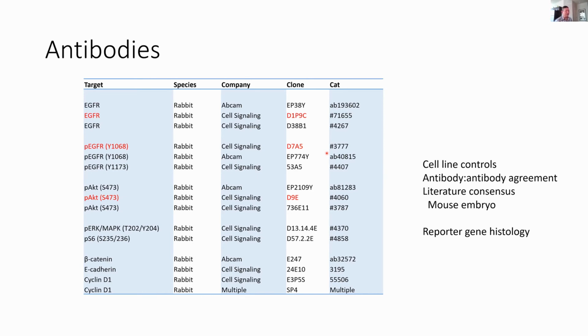Even for instance D9E, which I'm used to using in the prostate, I'm still not too happy with the signal it's giving in these polyps, and maybe it's because of sample preparation. So again, I'm just throwing these out there in case people have suggestions or insights, anything to do to improve the signals maximally before we start to go to town with these reagents.